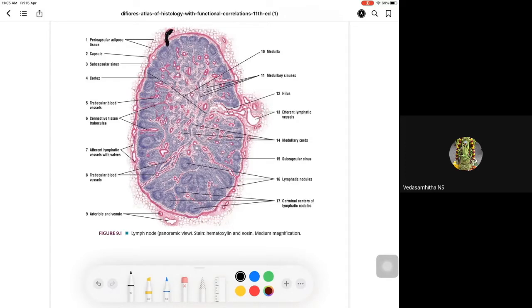But even in deepers, if they are seen only in the blood vessel, then what will you call, ma? Lymphovascular invasion. That's one point. Another point: sometimes the metastasis has happened in the lymph node. From here, they may extend outside the capsule. This is known as extracapsular extension.